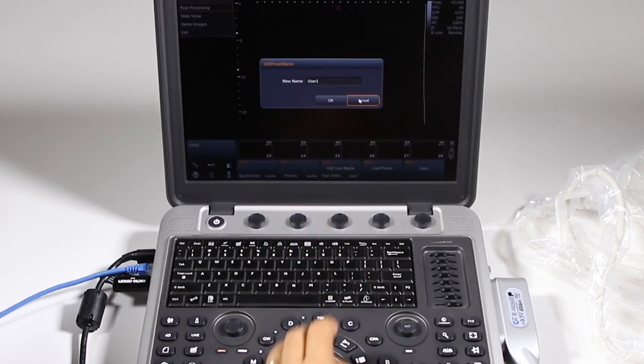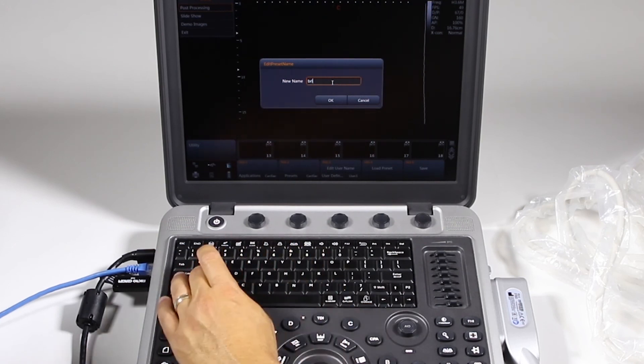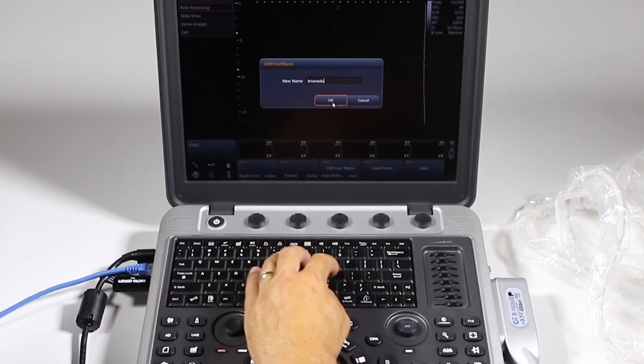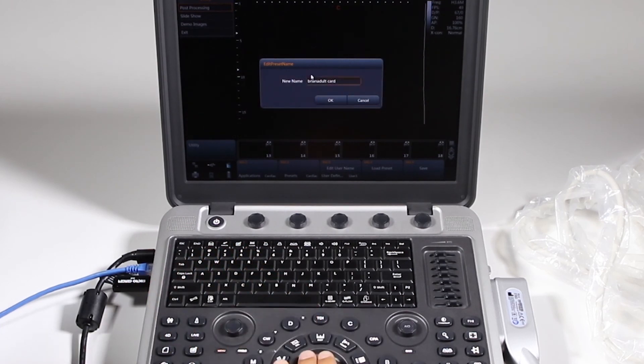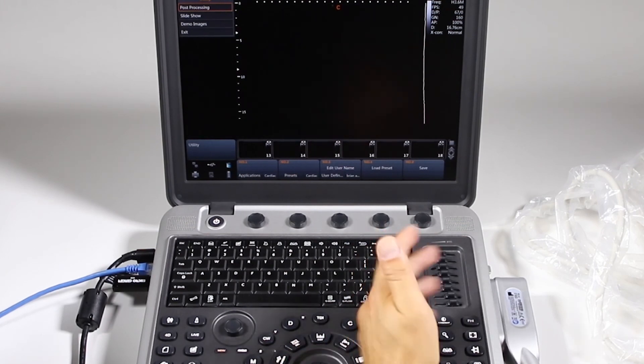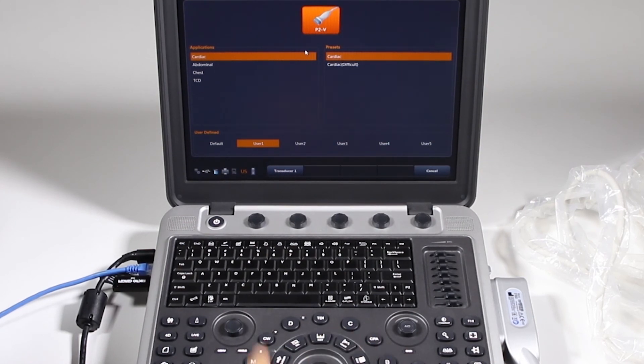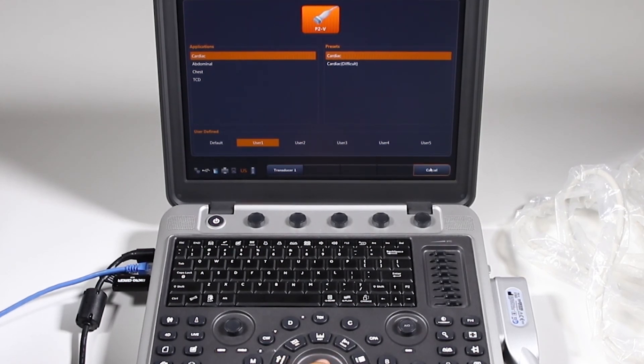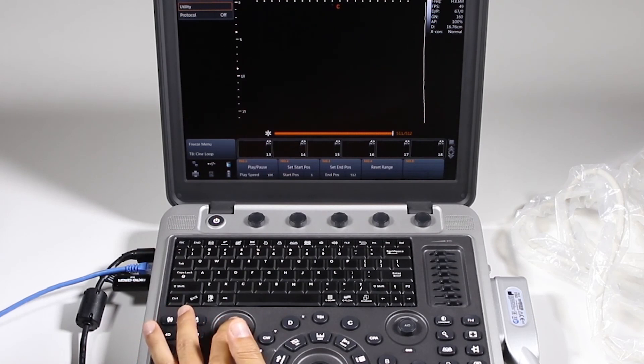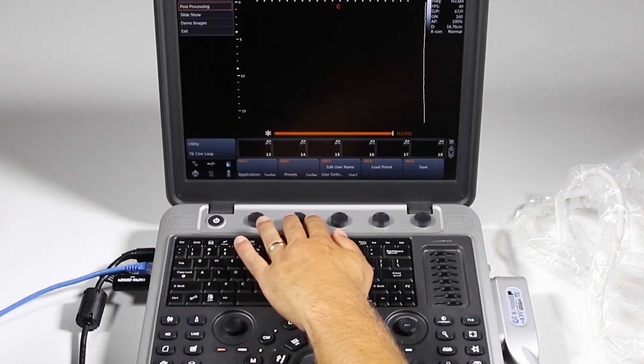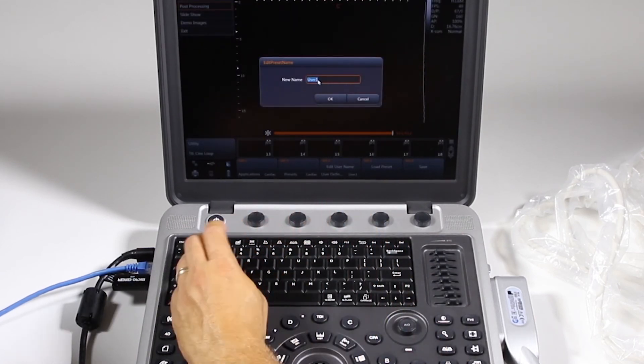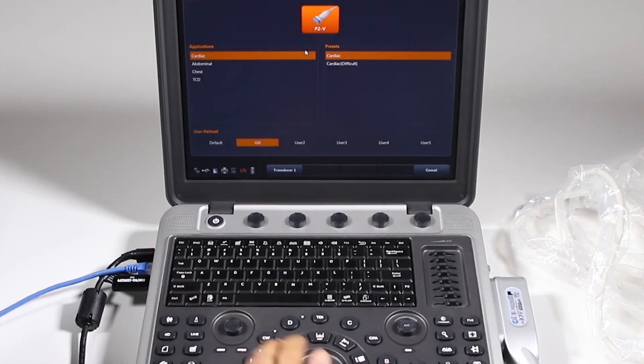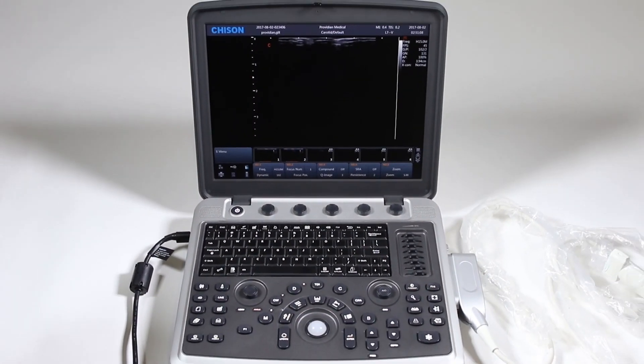If I want to change that name from user 1 to something else, I'll just type my name, which is a common if multiple users are there. You can say, like, Brian adult, cardiac, or something of that sort. Click OK. So now it's there. I can load the preset to whatever. But right now, I'll just show that probe button. OK. Now, notice I put in that custom name, and it doesn't have anything here. It just says user 1. The problem is I made a mistake and put spaces in that name. So I want to go back, click menu again, and then under utility, I'm going to click again. And it has these, and it says user 1. If I enter that user name again, and just type in my name, just without any spaces. Now I have it as Gil. And then when I go to this probe thing right now, it's got Gil as my own custom user preset. And next we'll get into Doppler and M mode imaging.